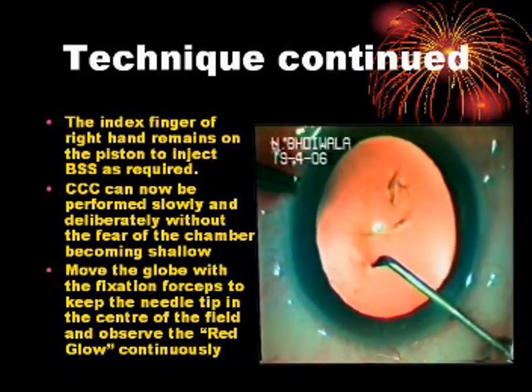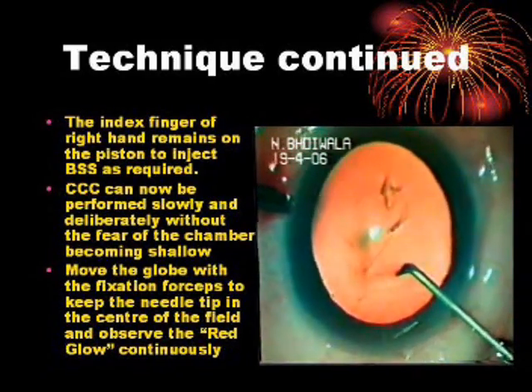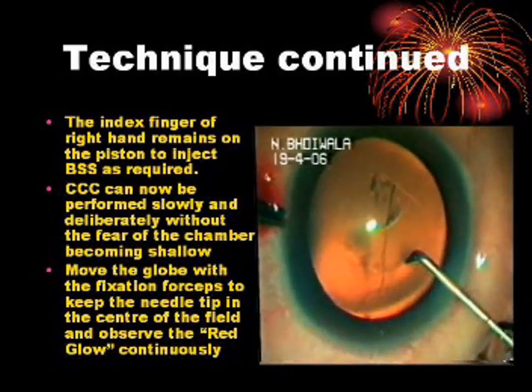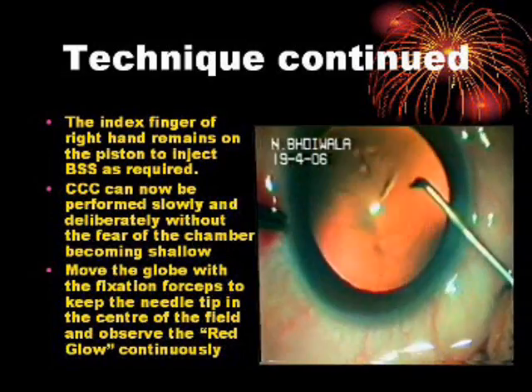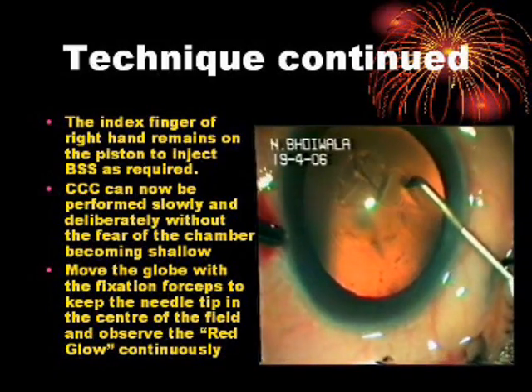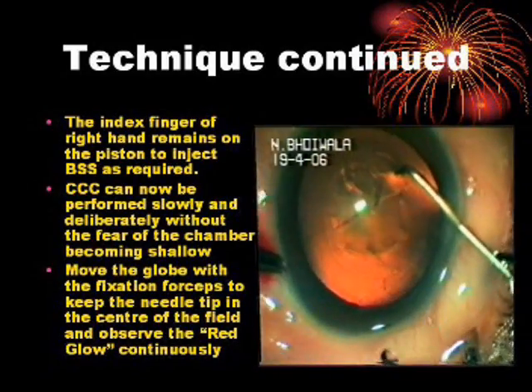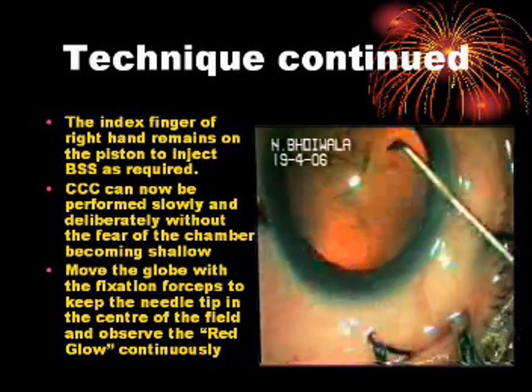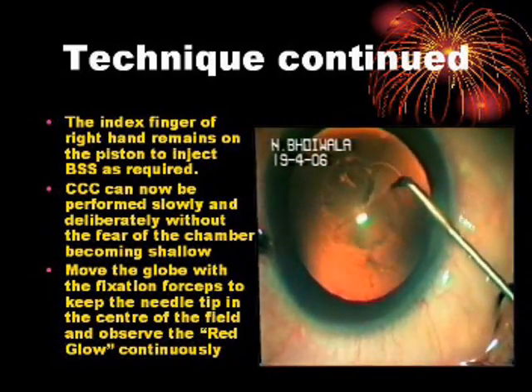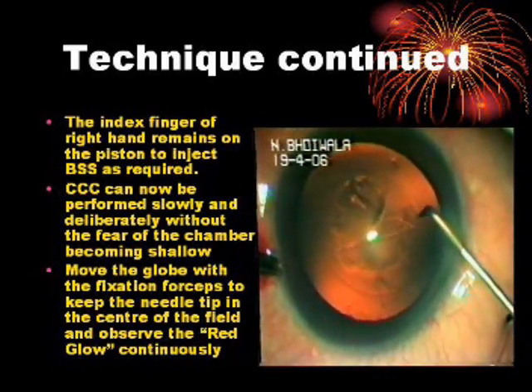Move the globe with the fixation forceps to keep the needle tip in the center of the field and observe the red glow continuously. The index finger of the right hand remains on the piston to inject BSS as required to support the anterior chamber.